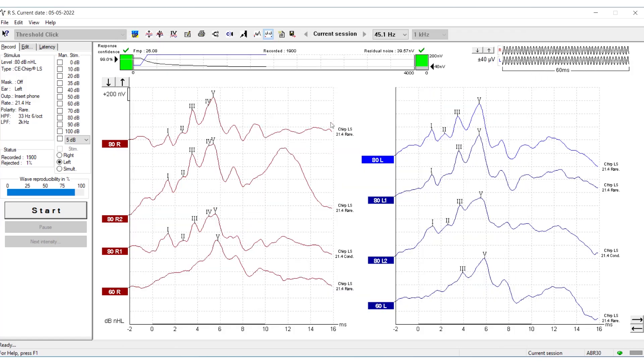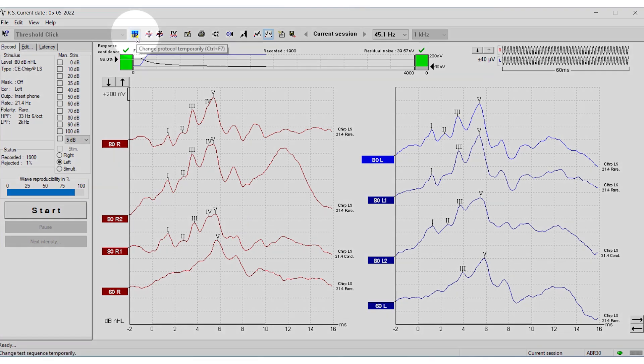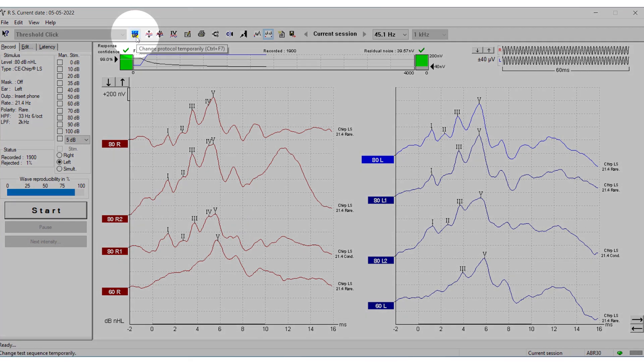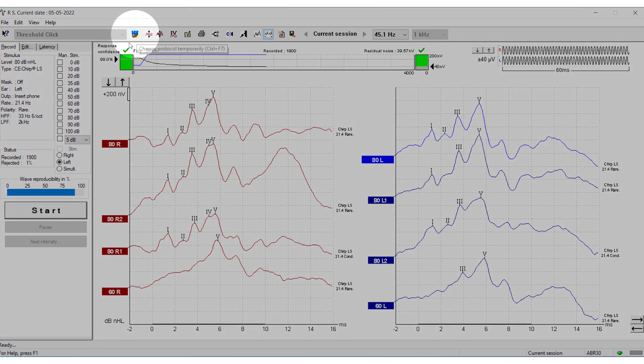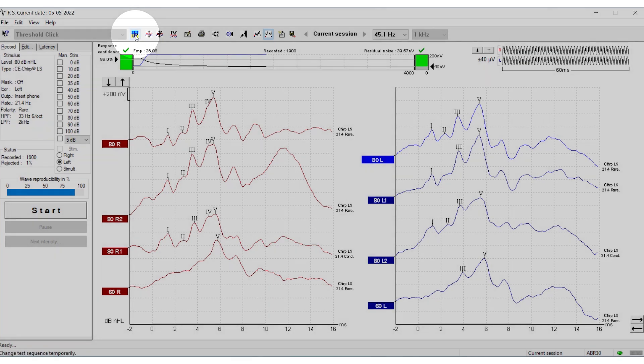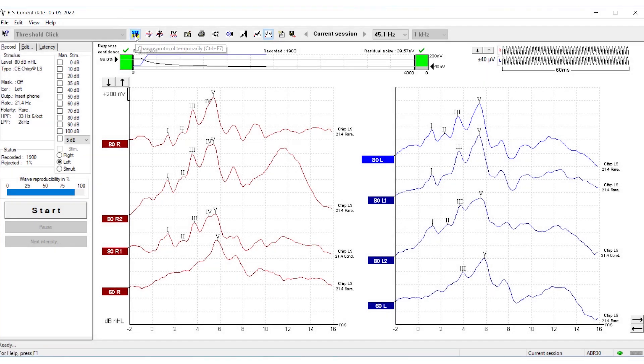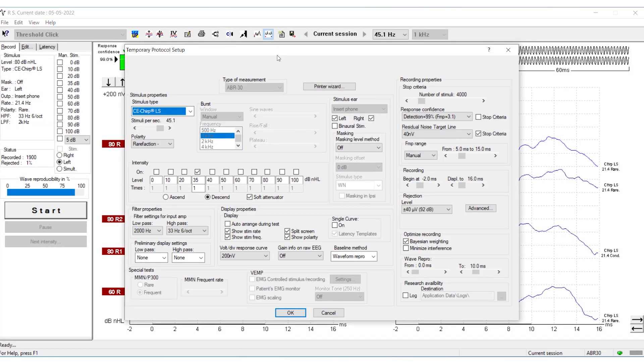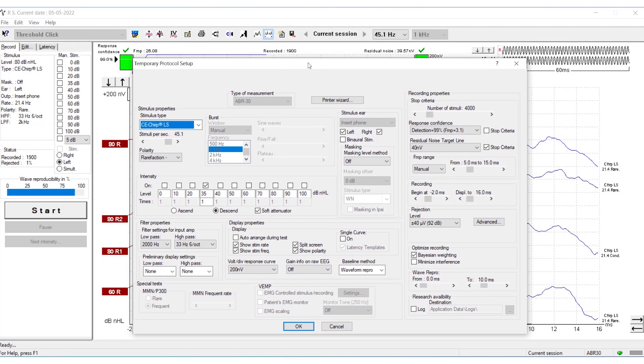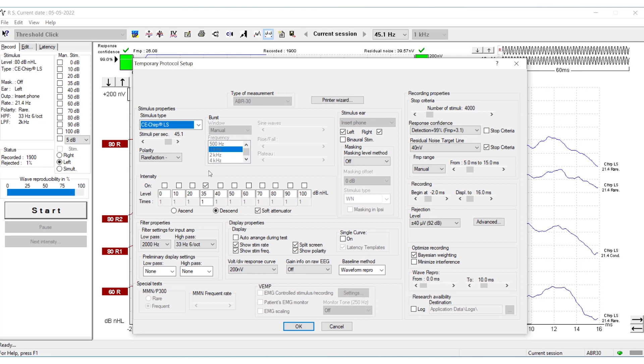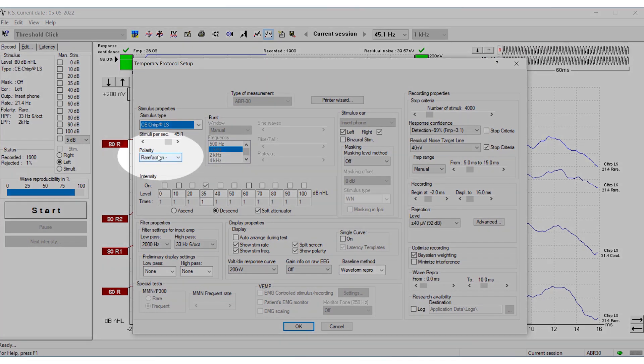If you want to make a temporary change in the protocol, click the teal and yellow Setup button. For example, if you have made an ABR measurement and want to change from rarefaction polarity to condensation polarity for this measurement, you can do that here.